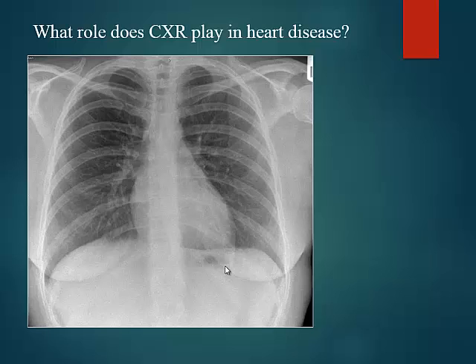Okay, other uses you may think of? In which other situation would you use a chest X-ray? So putting a device. After putting a pacemaker or an ICD, you want to check the position of the leads. You want to check for any complications. Yeah, that's an important indication for which chest X-ray is mandatory.